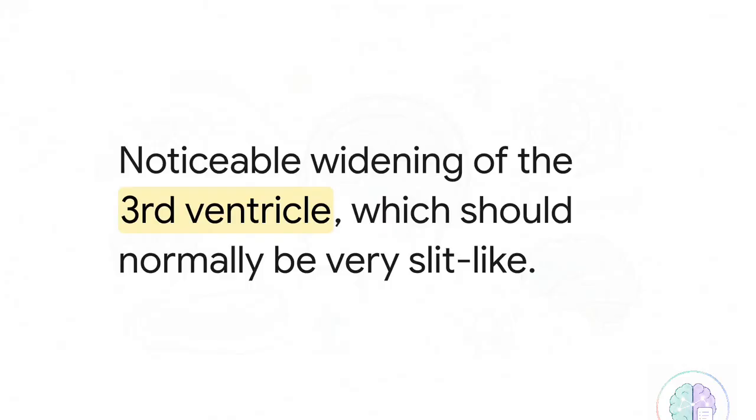Next, look down at the third ventricle. Normally, it should be this very tight, slit-like space. If it loses that sharp shape and becomes noticeably widened, that's a massive red flag staring right back at you.